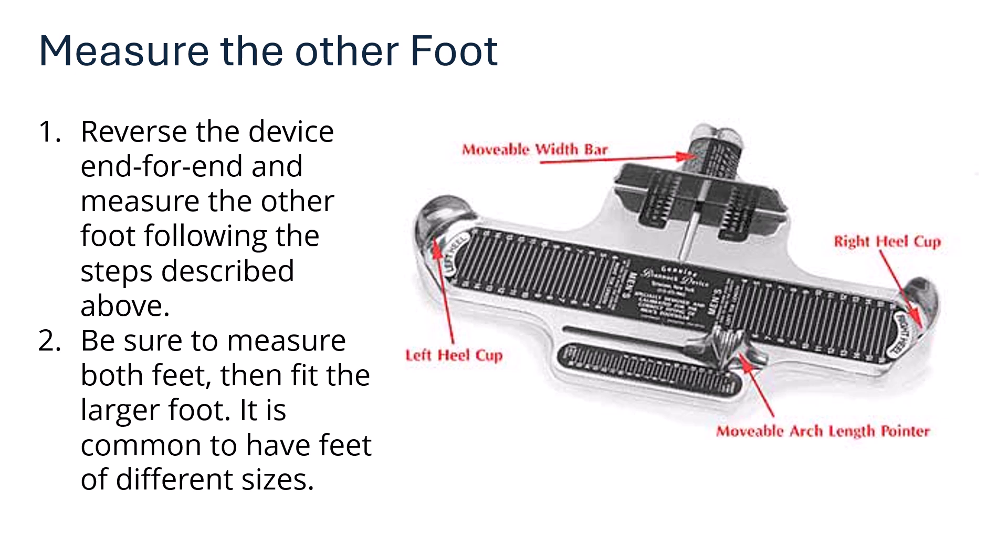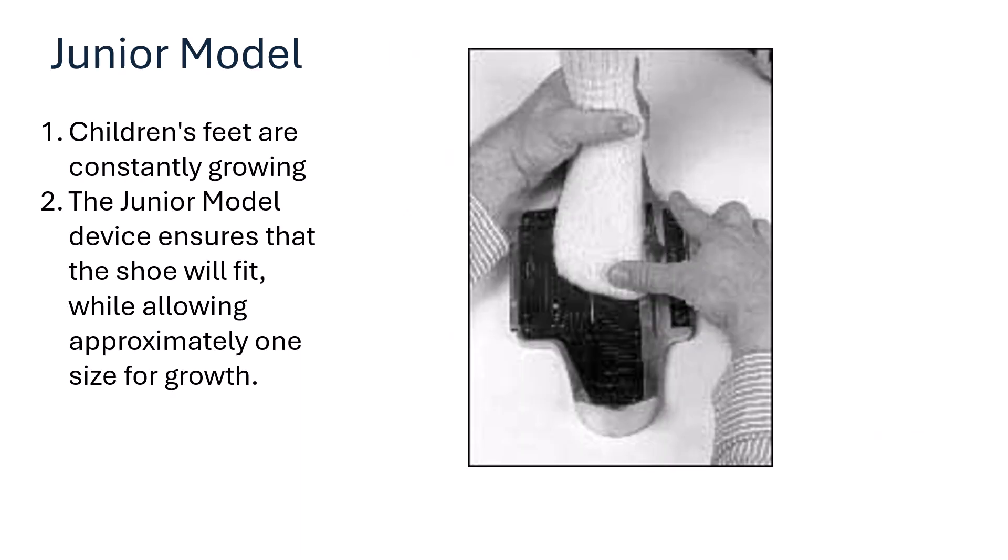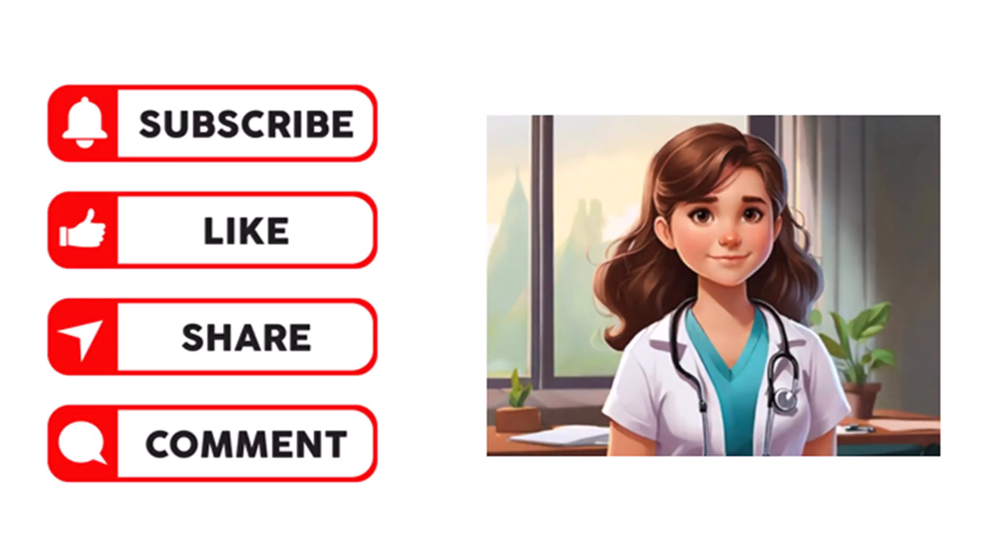Measure the other foot as well — due to structural deformities, one foot can differ from the other. Reverse the device for the opposite foot and follow the same steps. Always measure both feet, then fit to the larger foot. It is common to have different foot sizes. There is also a junior Brannock device model available for children, whose feet are constantly growing — the junior model ensures the shoe will fit approximately one size longer for growing room.